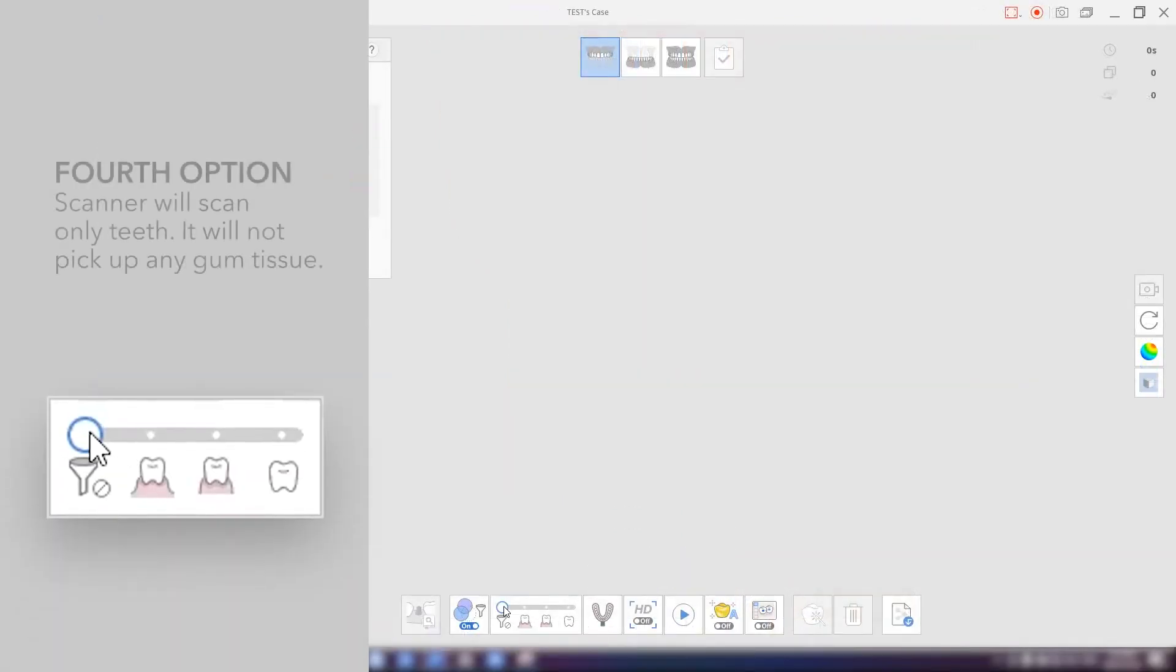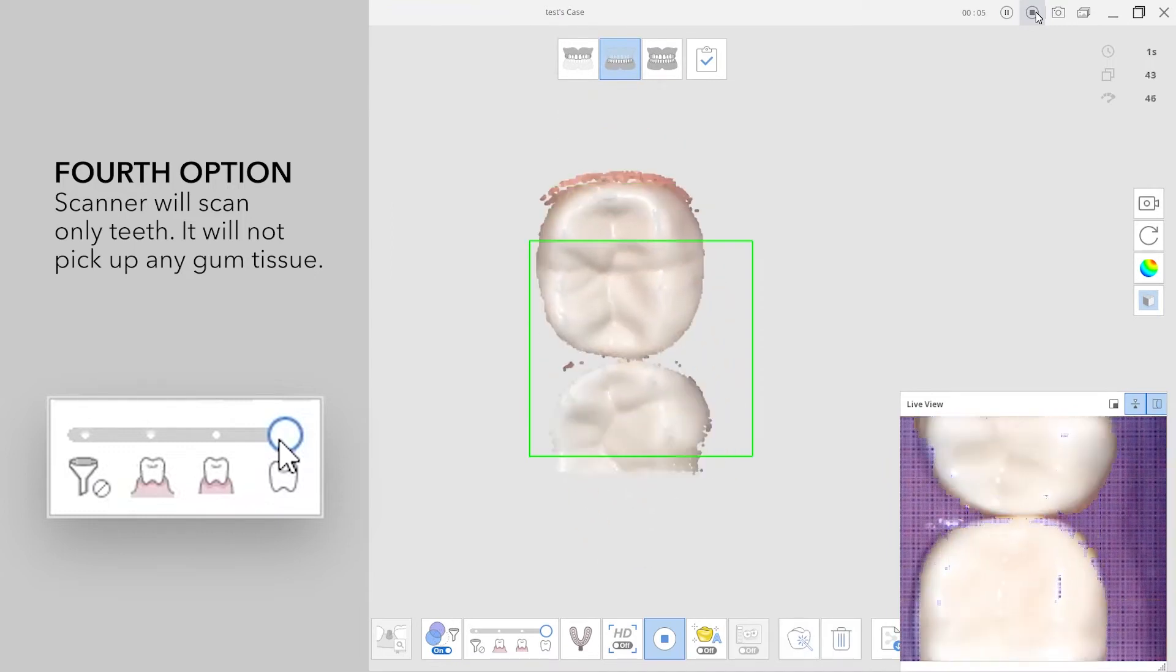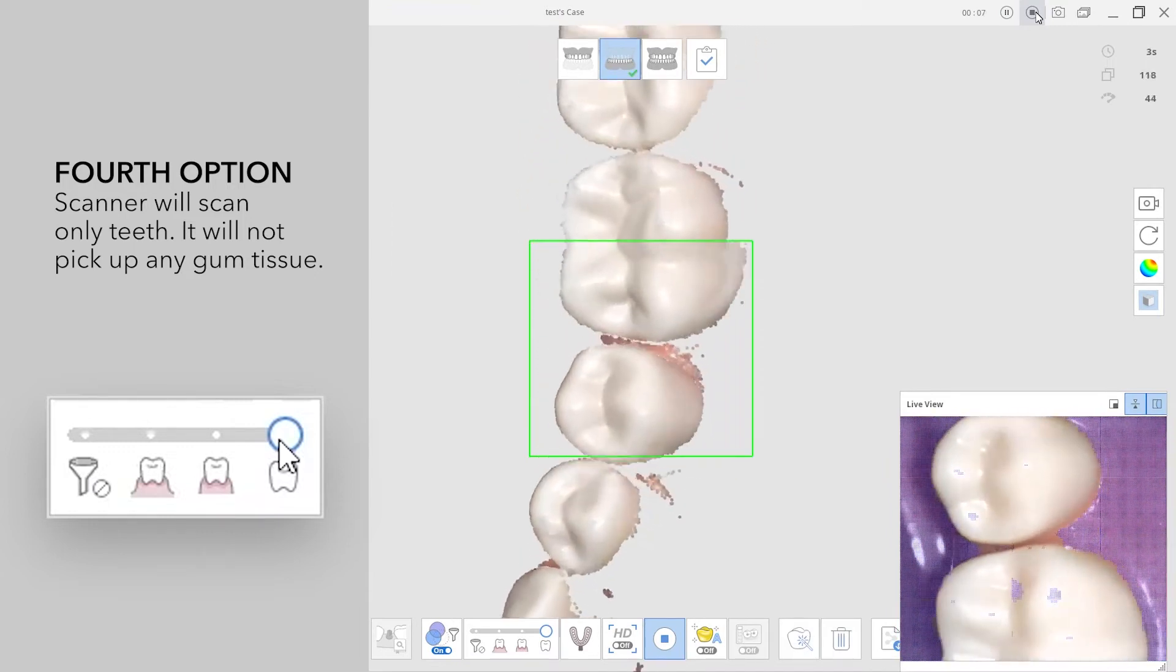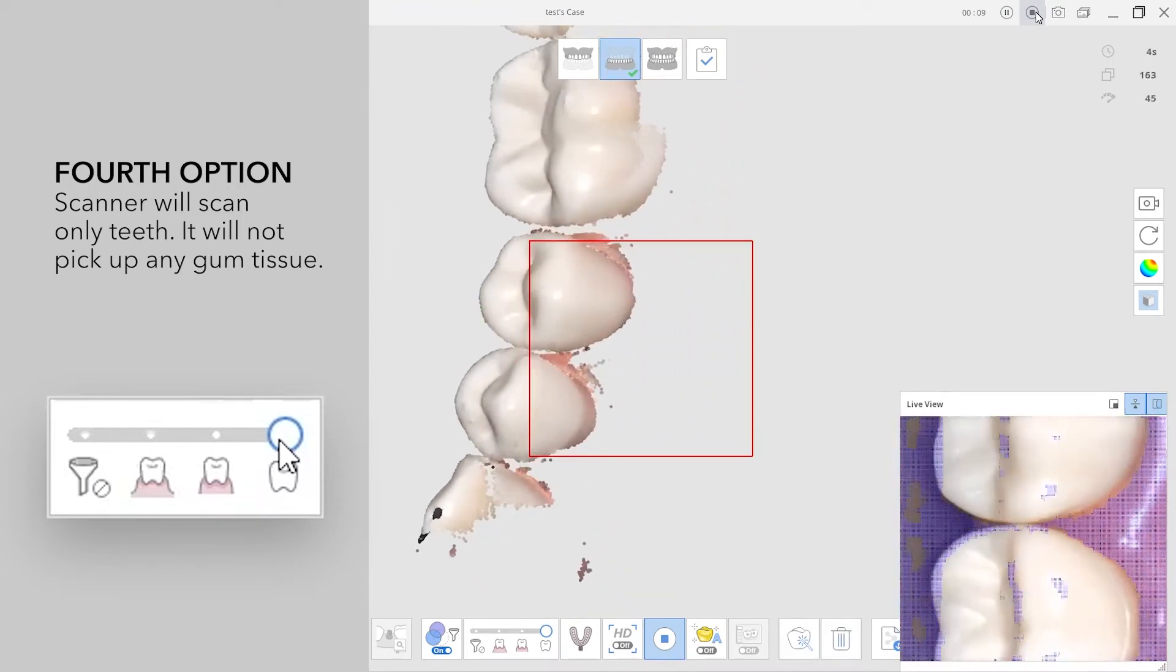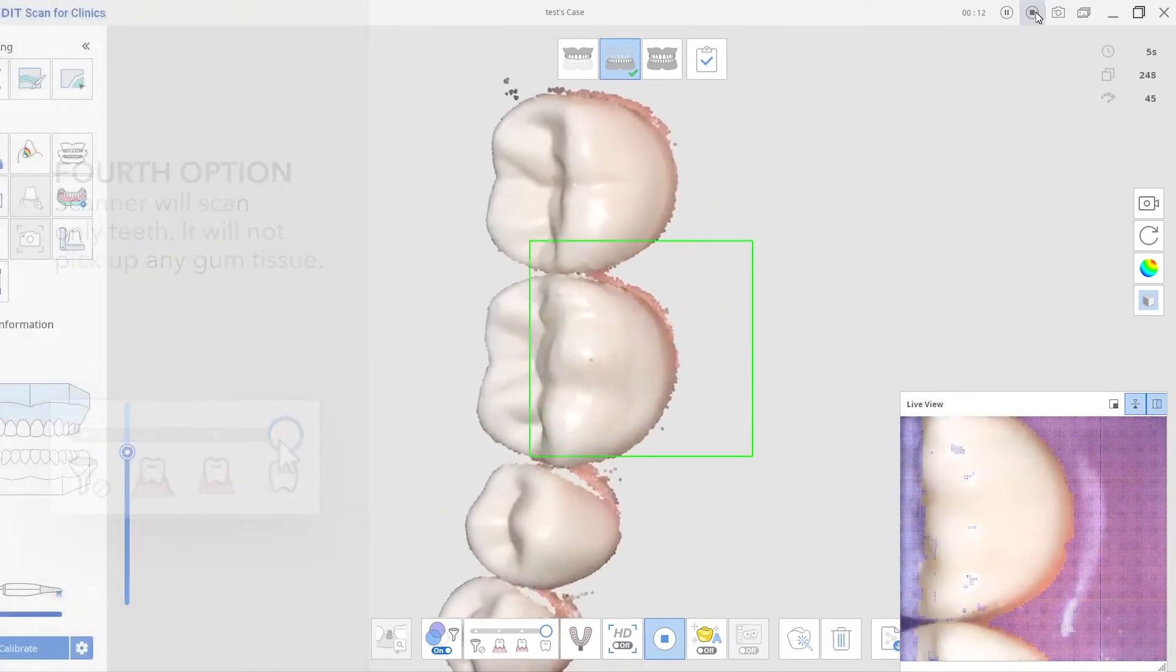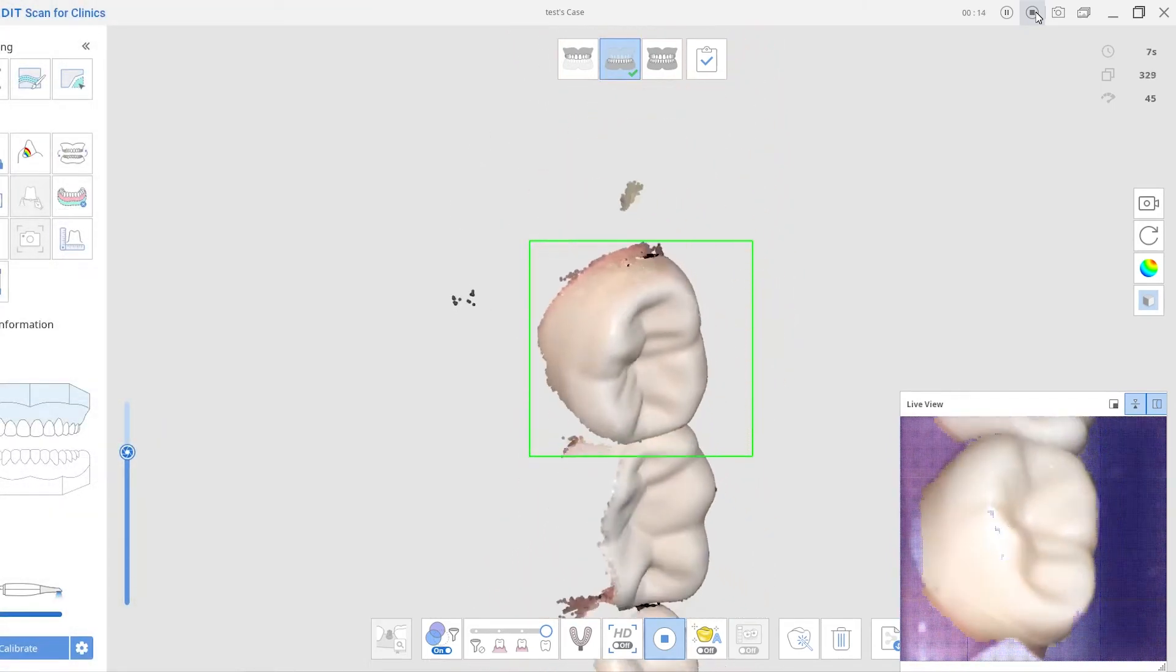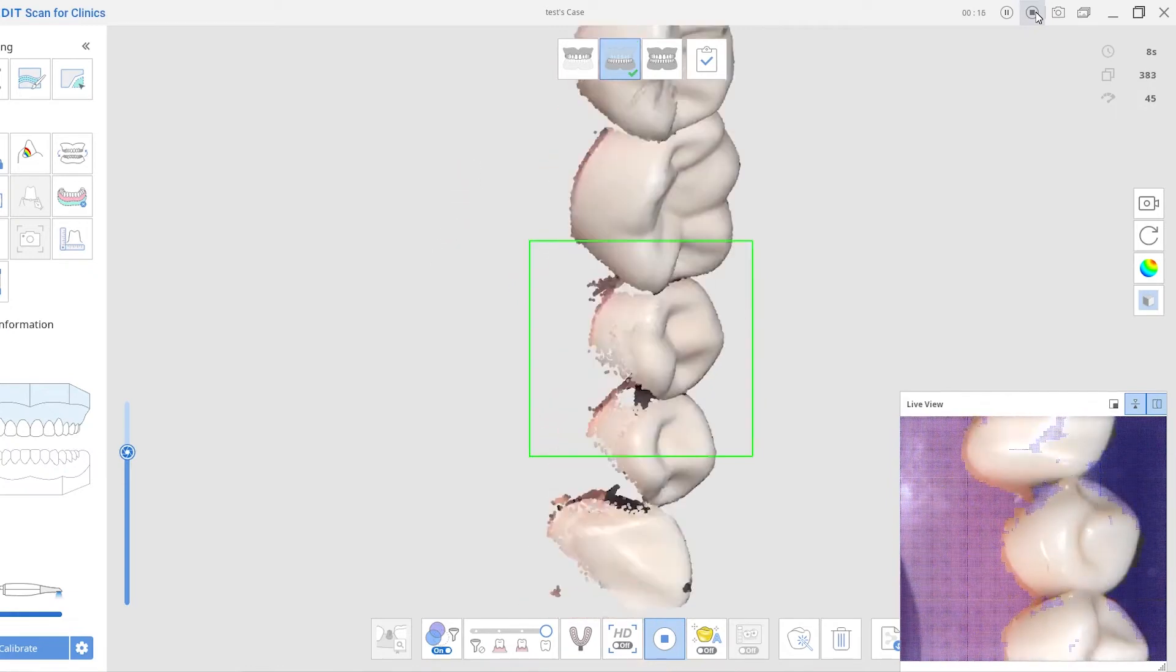If I slide all the way to the right here, this is only going to focus on scanning the teeth. You're not picking up any more gum tissues. This will block the gum and only focus on scanning the teeth. It's good for additional scanning when you scan the proximal areas.